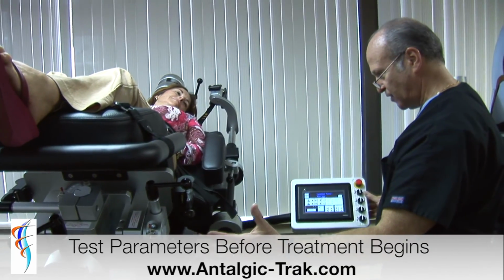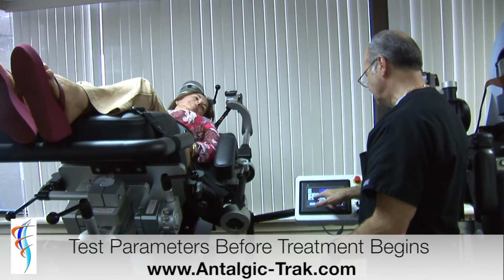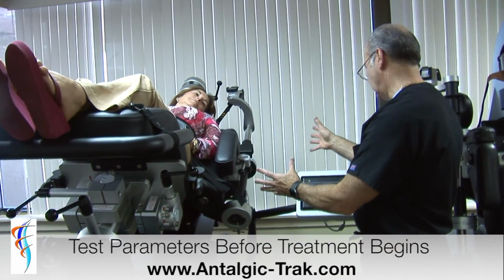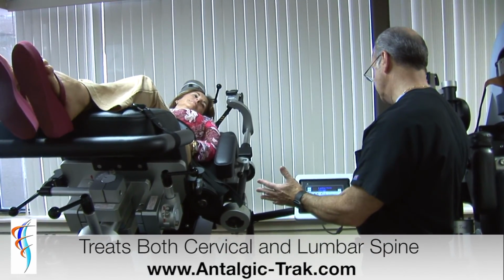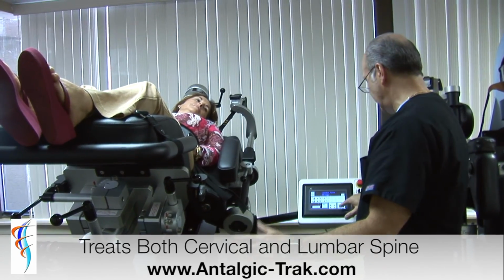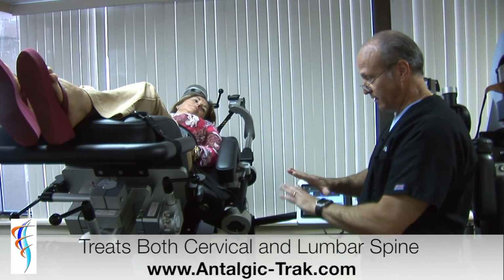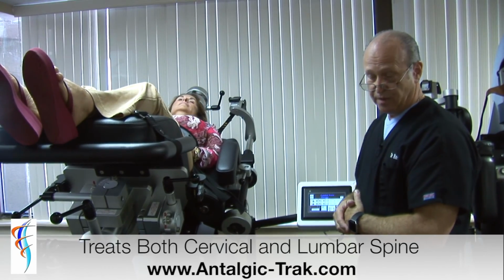So now I'm pulling for 3 seconds, I'm releasing for 2 seconds, and that's where I can modify or change my poundage parameters without having to wait for 30 or 45 seconds and 10 or 15 seconds on the rest. So here I can see I'm pulling at 100 pounds, I'm releasing to 60 pounds, and then my therapy might actually be 30 seconds of pull and 10 seconds of release. And that will continue for the time setting, and then the machine will automatically stop and bring the table back to neutral. And that's a lumbar treatment setting.